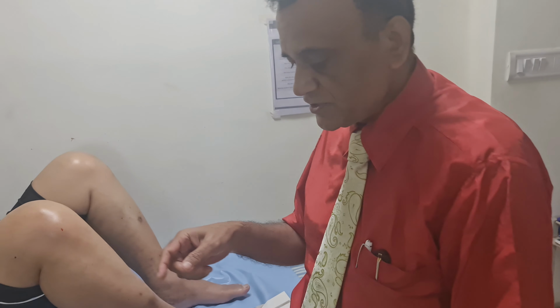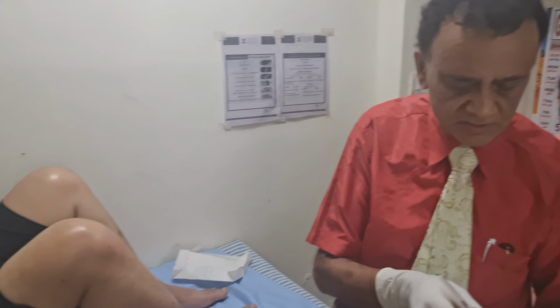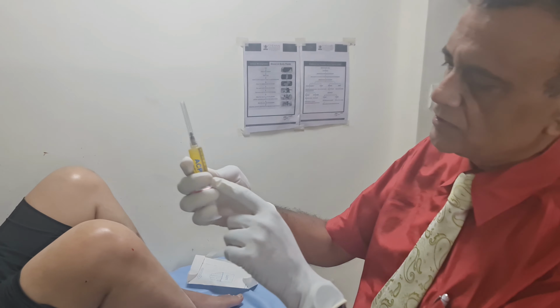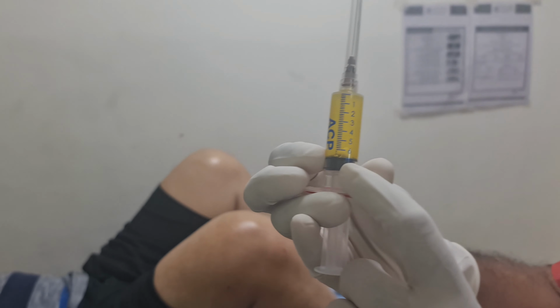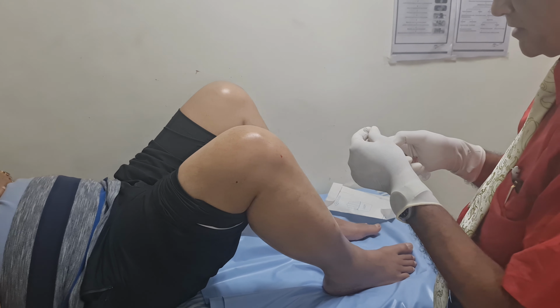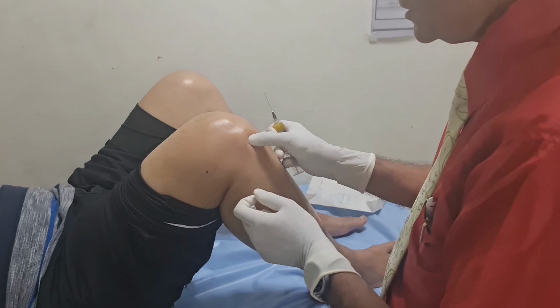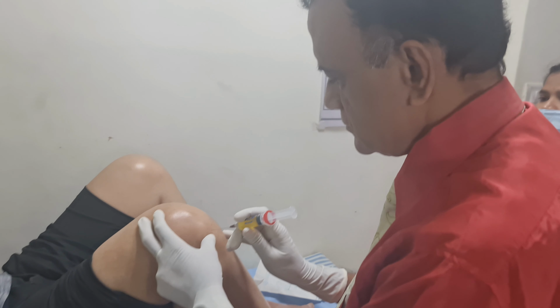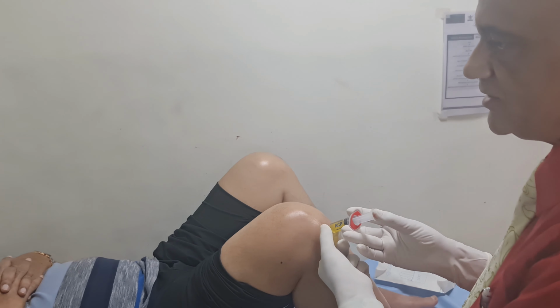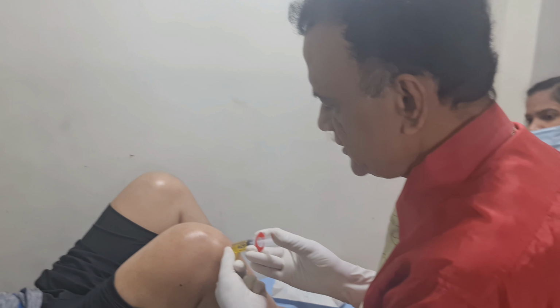The PRP procedure injection is done in the office. Now I am ready to inject the first knee with PRP. We have got 6.5 ml of PRP. The area has already been numbed with the local anesthetic. And this is the area. He felt no pain when I inserted the needle into the knee.